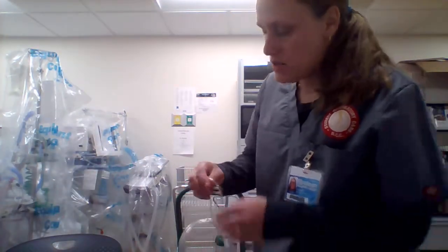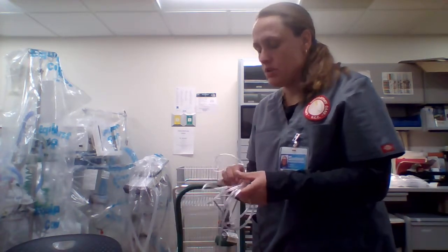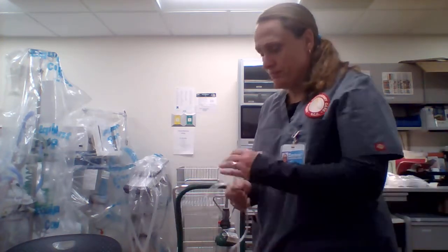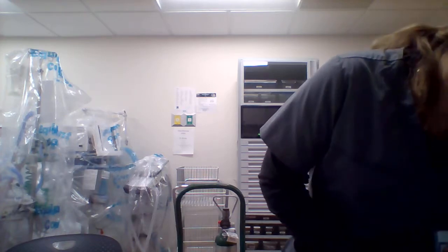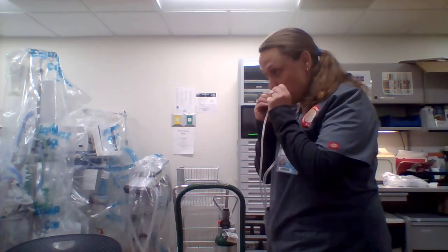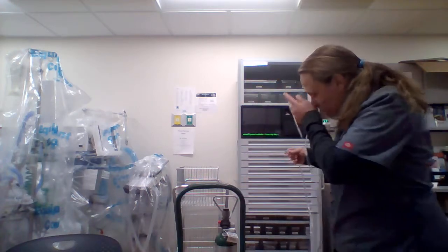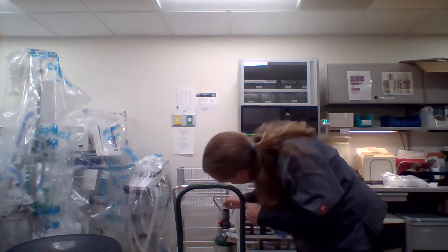So here's a nasal cannula. This is getting anywhere from 0.25 liters, or a quarter of a liter, up to 6 liters. And let me double check that. I think it's 8. Yep, it's 6. I was right. So it's got little hooks on here. You want this inside your patient's nose, facing this way. Going this way, it'll just hit the nares. So we would plug it in here. Turn it up to 4.